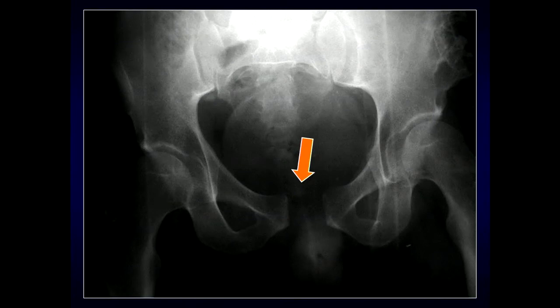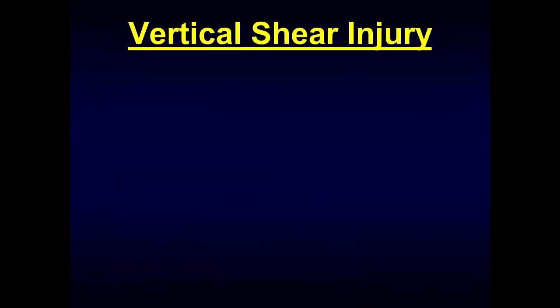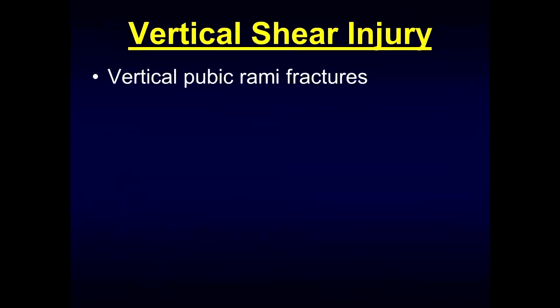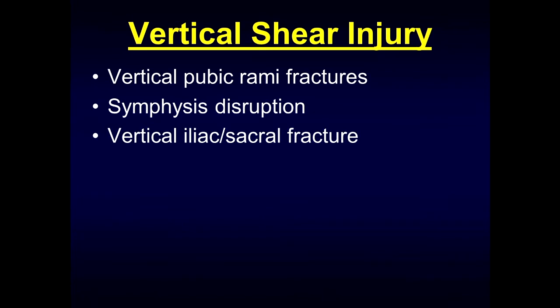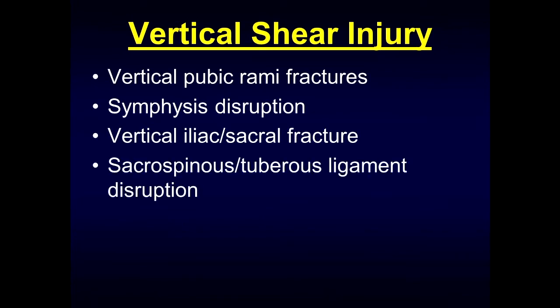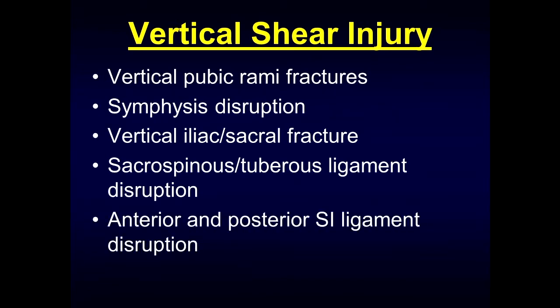In this patient, you can see there's widening of the pubic symphysis, widening of the sacroiliac joint, and fractures through the sacral ala. The vertical shear type of injury involves vertical pubic rami fractures, disruption at the symphysis, vertical iliac and sacral fractures, sacrospinous and sacrotuberous ligament disruption, and anterior and posterior SI joint ligament disruption. The key finding is superior displacement.